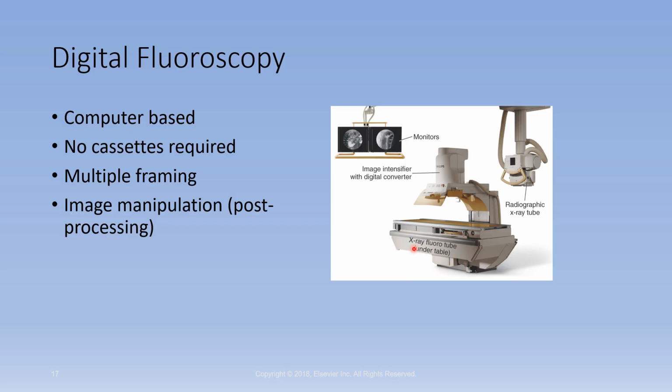And then when you do the fluoro, the radiologist and yourself and potentially the patient is viewing what's going on on the monitor. Okay, so with digital fluoroscopy, basically there are flat panel detectors and a computer to manipulate the image and to store that.